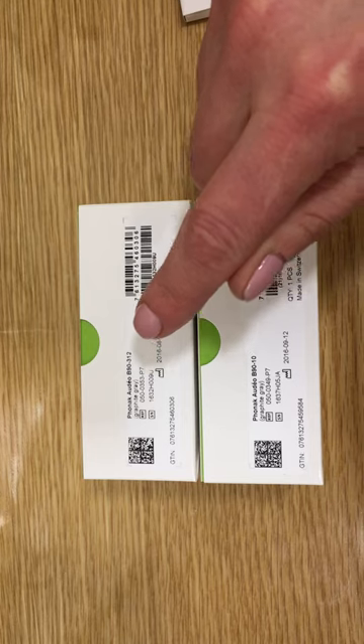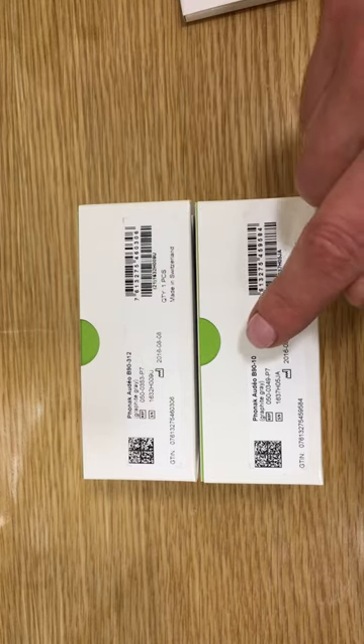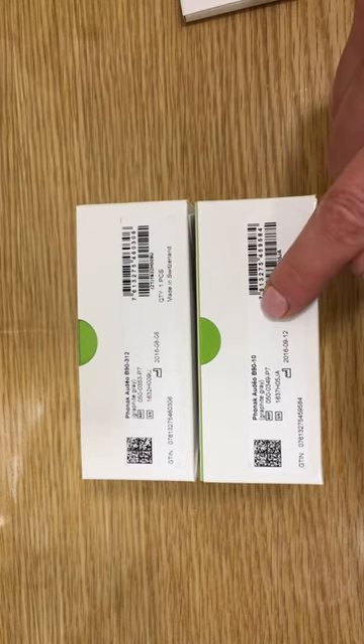The numbers 312 and 10 relate to the battery size. The 10 will therefore be a smaller instrument.